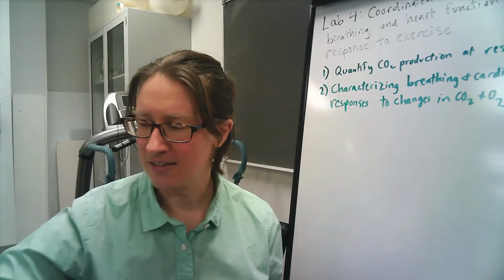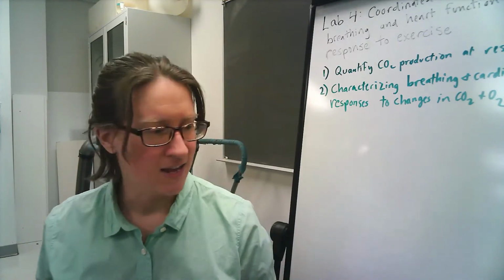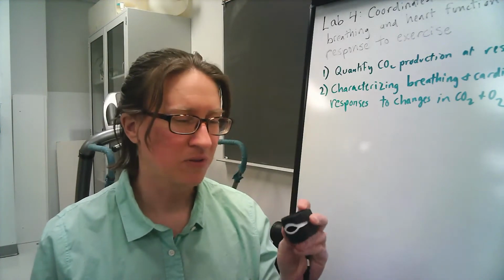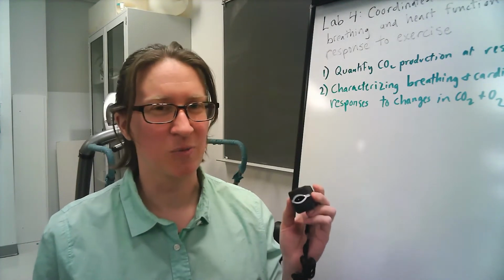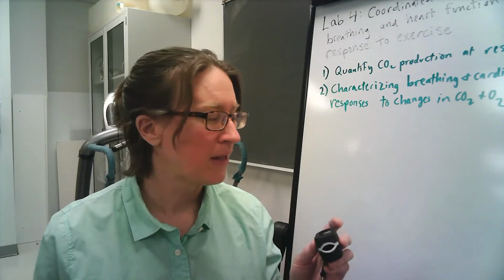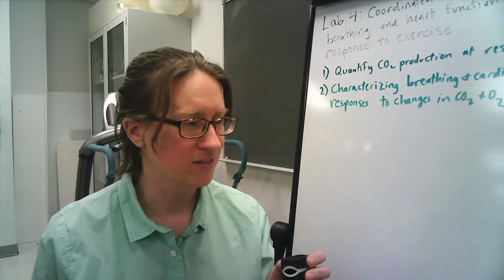And so for this exercise, what we would ordinarily do is take a finger pulse oximeter. Before the pandemic, not that many people had worked with finger pulse oximeters, but as a result of the pandemic, people now know a lot more about them because they're a really excellent way of tracking your blood oxygenation levels with some caveats.